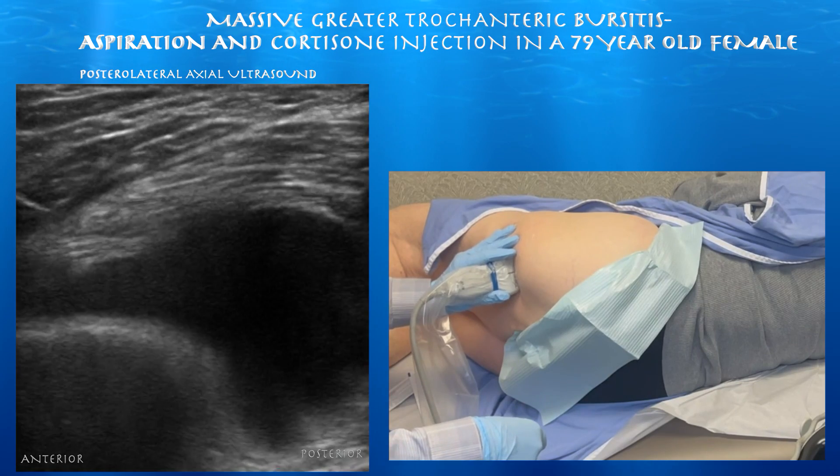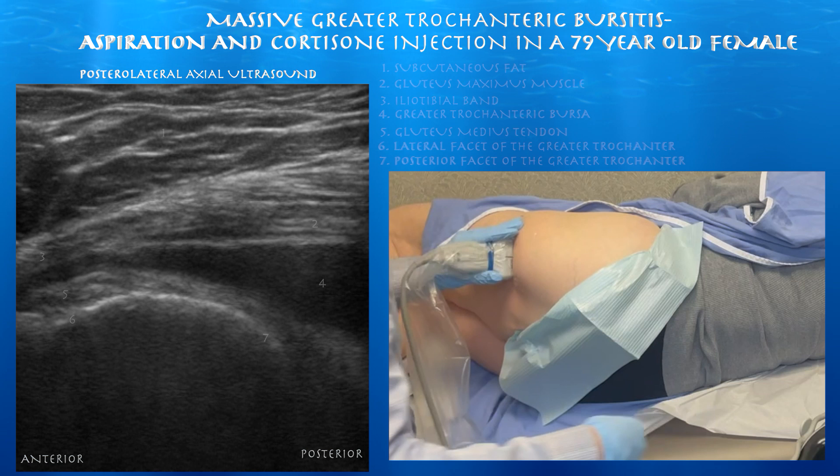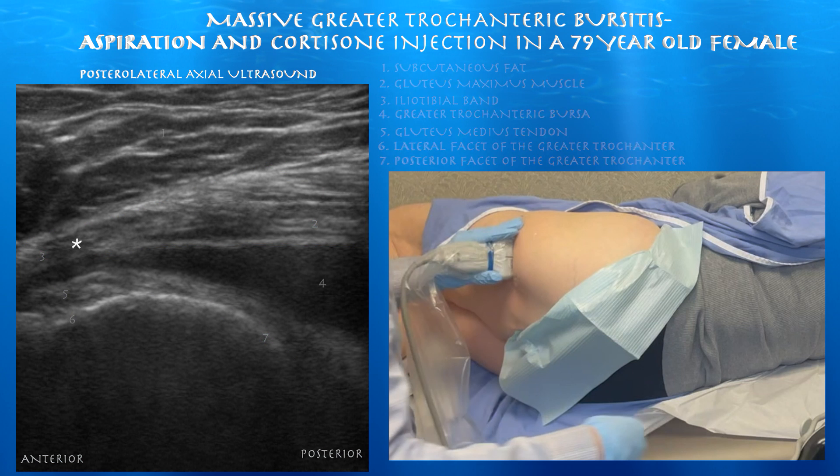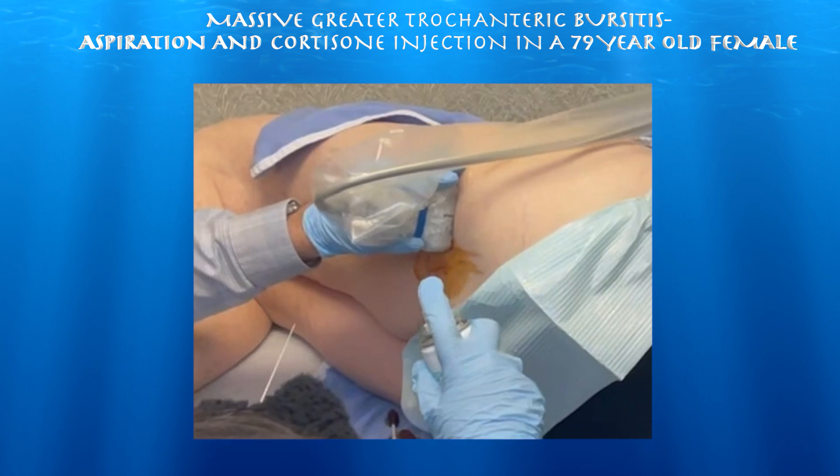Here we are looking at the lateral hip. You can see this essentially massive greater trochanteric bursitis with an extremely large bursa underneath the iliotibial band, between that and the gluteus medius tendon.